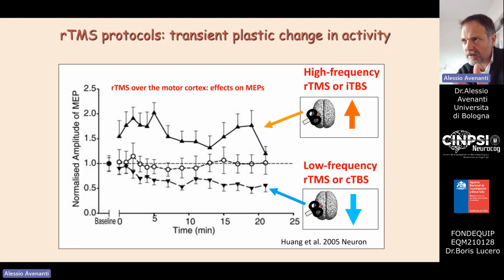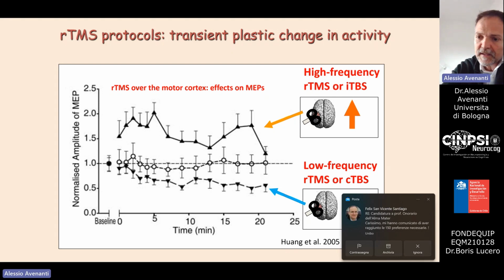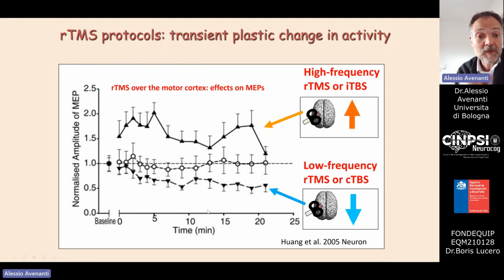If we do not control for specific factors, such as what the subject is doing, then we can observe quite huge variability. So it's very important to control each phase of the stimulation and maybe to manipulate those phases in order to test the effect of the different manipulations. Okay, I would just like to say a couple of things and then we make a little break.